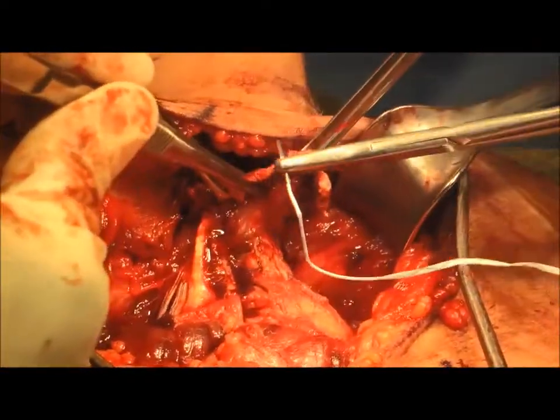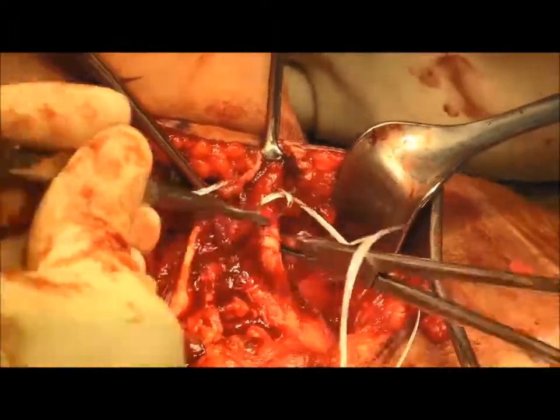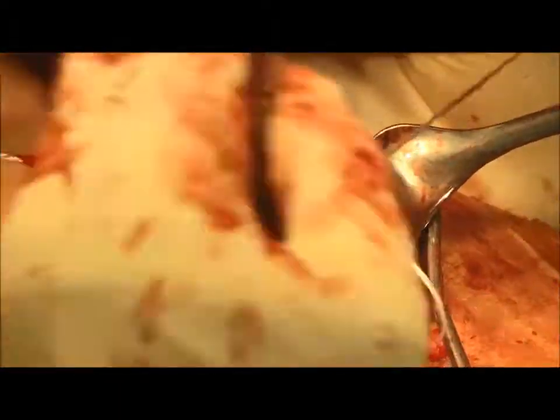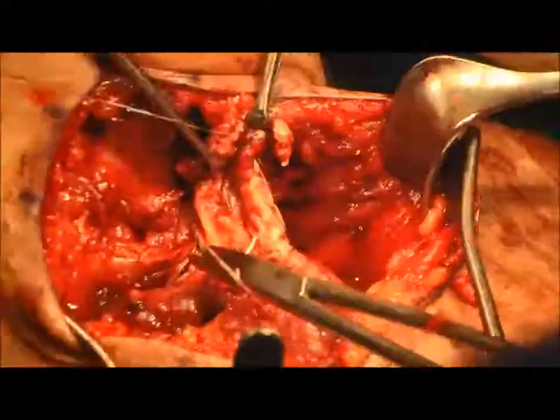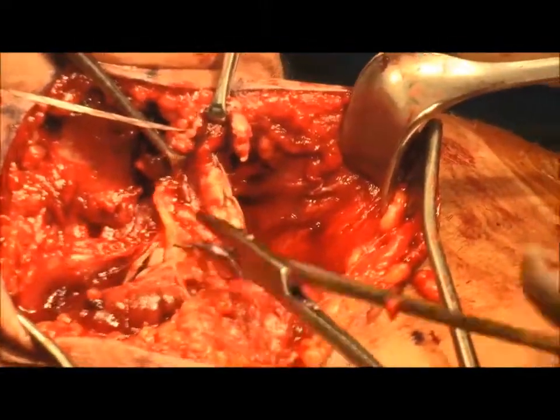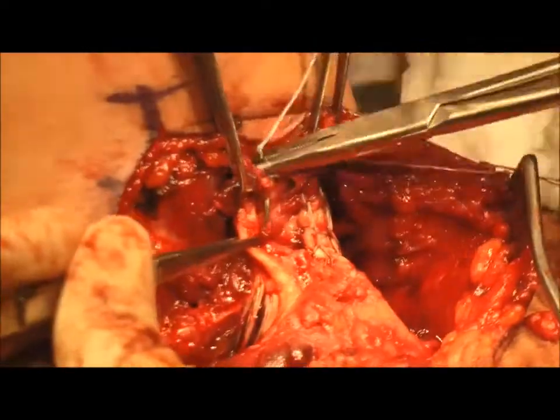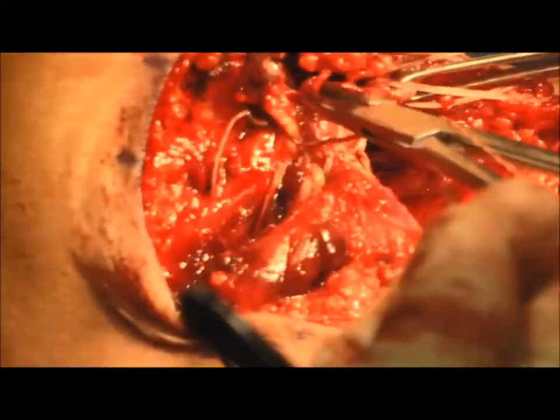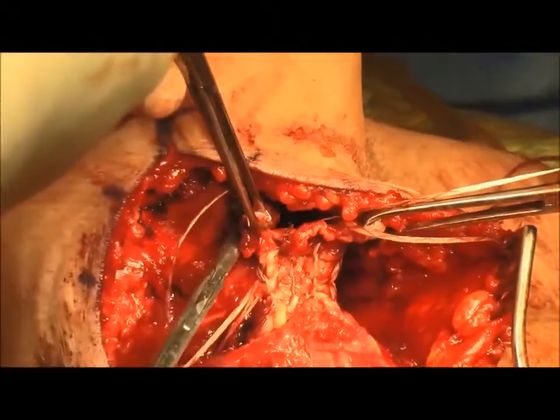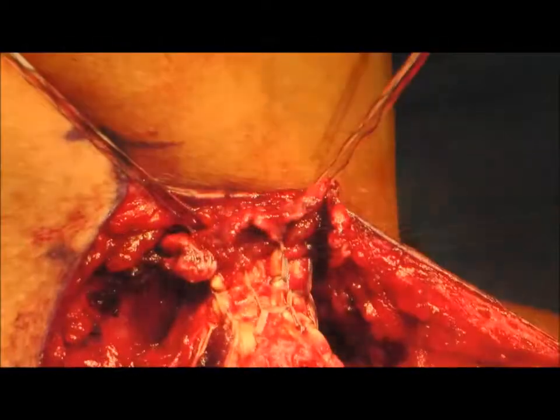We then turn our attention to the tendon. We plan to pass two suture tapes through the tendon in a simple locking Krackow fashion, in order to create four limbs that will be used through the two cortical buttons. The first suture tape is now passed through the tendon, followed by the second suture tape in the same manner, creating four limbs as shown.